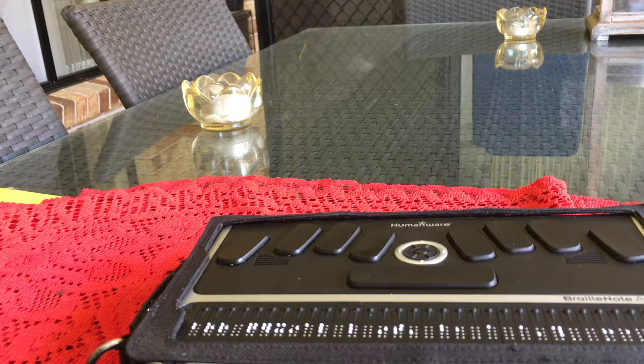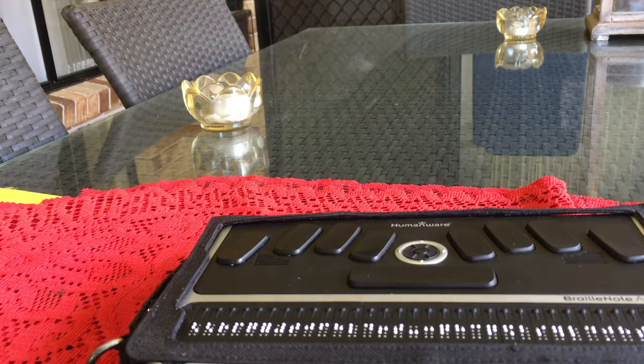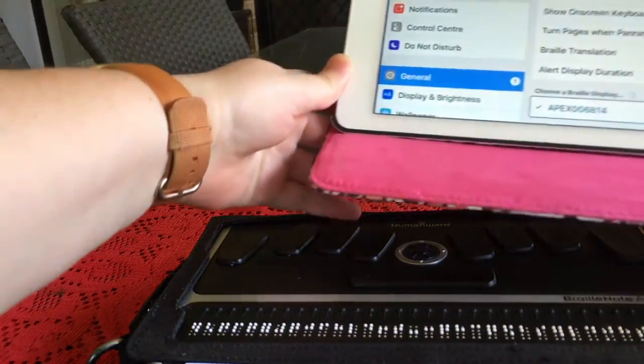This could be easier, but let's just do it. Apex, zero, zero, six, eight, one, four. Secure text field. Zero. Done. Setting. Four zeros and done. Connecting. Button. Selected. Apex — and it's connecting. Apex, zero, zero, six, eight, one, four — connected. I'll set this up so you guys can see it. Hopefully you can see that, if you are someone who uses looking at stuff.